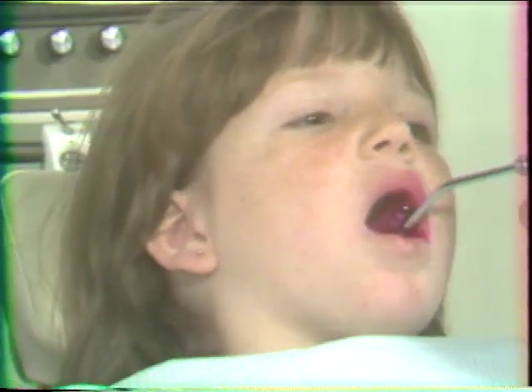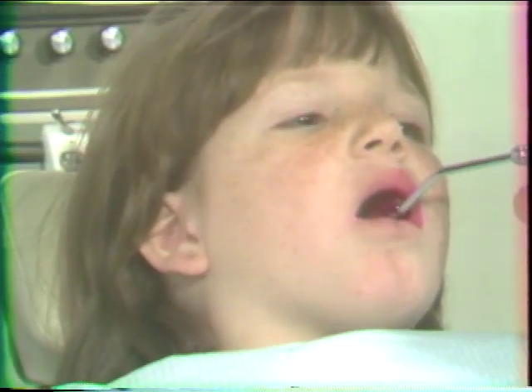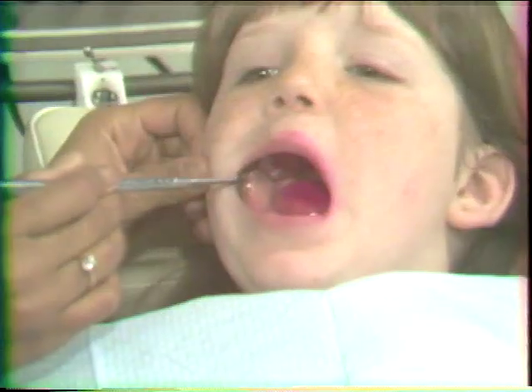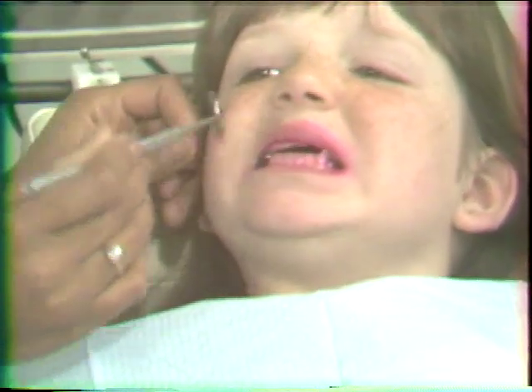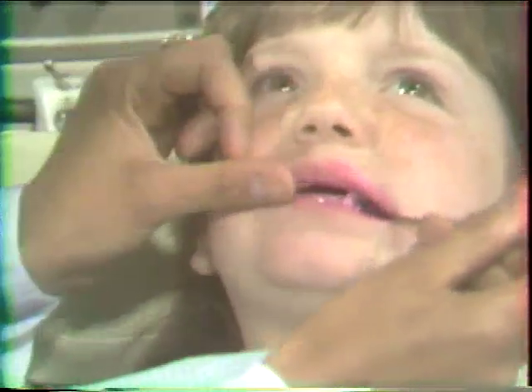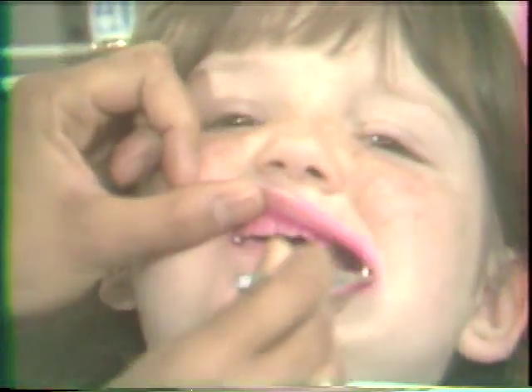With very young children or those with disabilities, a cotton applicator dipped in disclosing solution may be applied to the teeth. After having the patient rinse with water, you should examine the teeth for areas of plaque accumulation and calculus deposits. The most frequent area of calculus deposit accumulation is the lingual surface of the mandibular incisors.